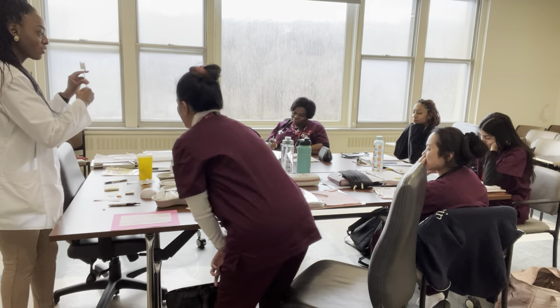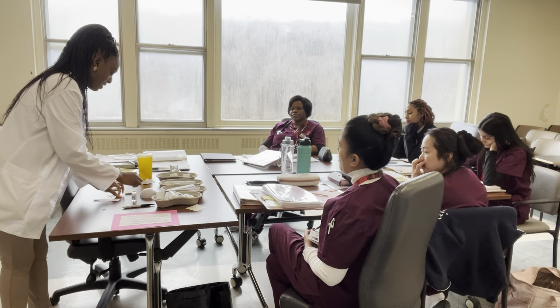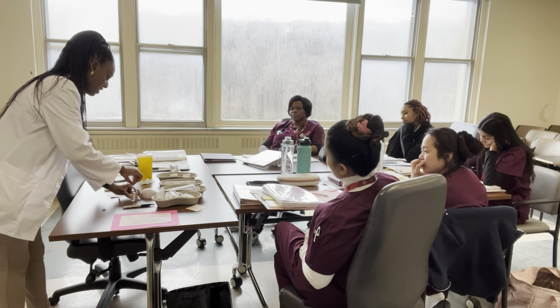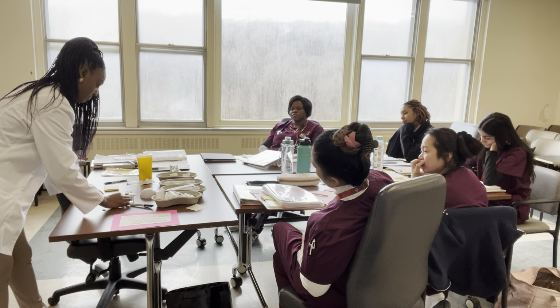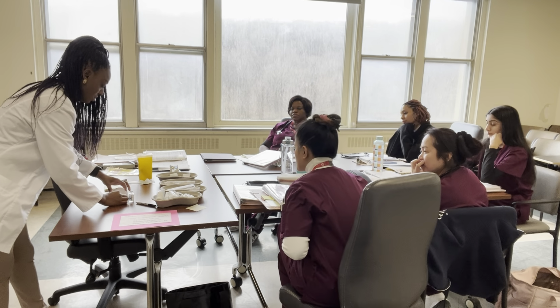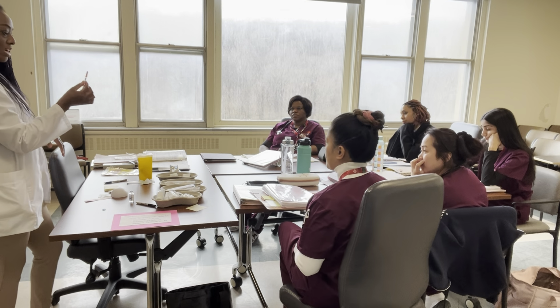Then, don't remove the syringe while she's near you because you can poke her, right? And then afterwards, you make sure you place the cap first in a place that's not going to roll around. Then you take out the syringe. I usually take it out this way, so it's easier for me to put it in. You saw what I did? Usually they'll say push it against something first, and then you click it. Good? So now I know I have the right amount.